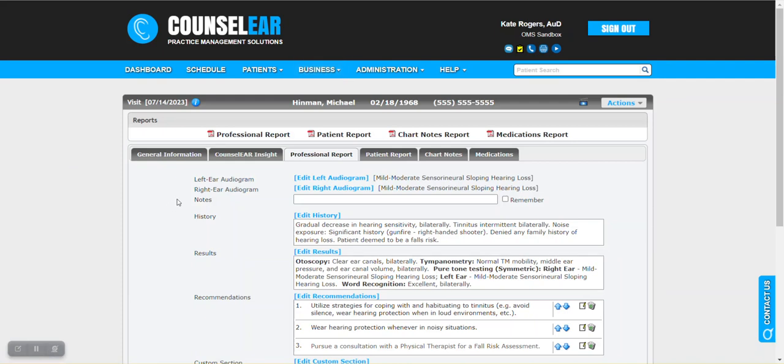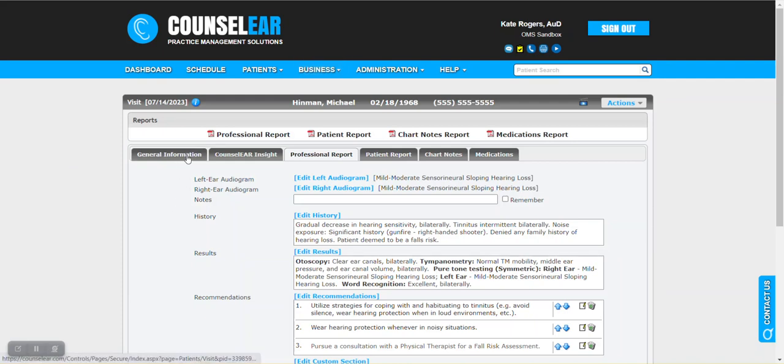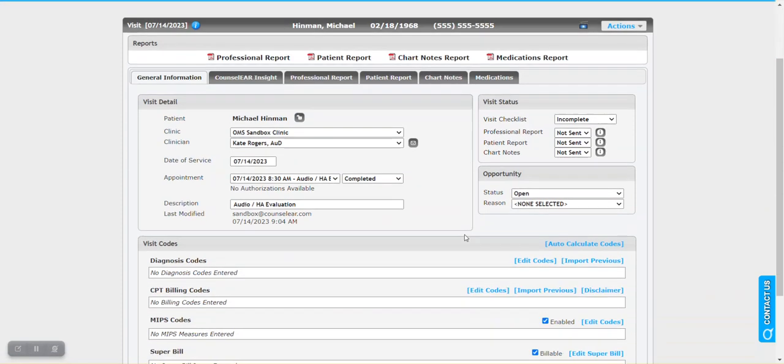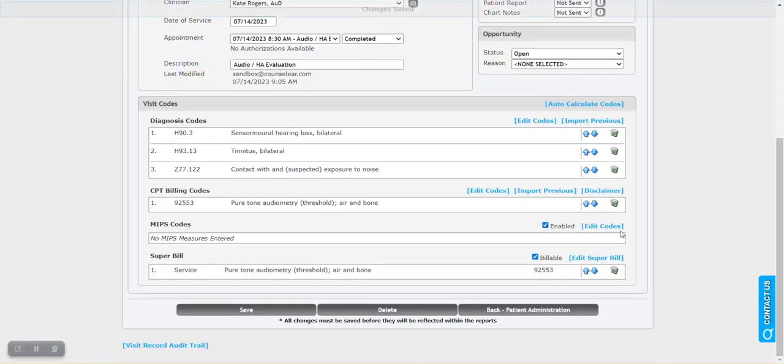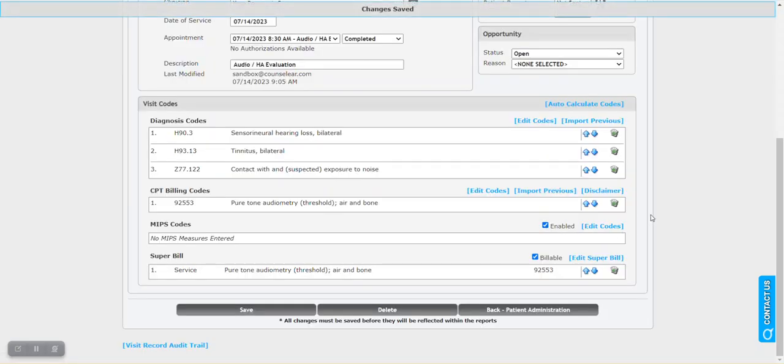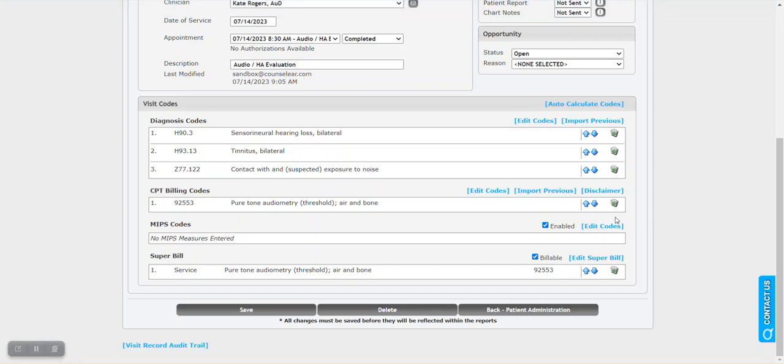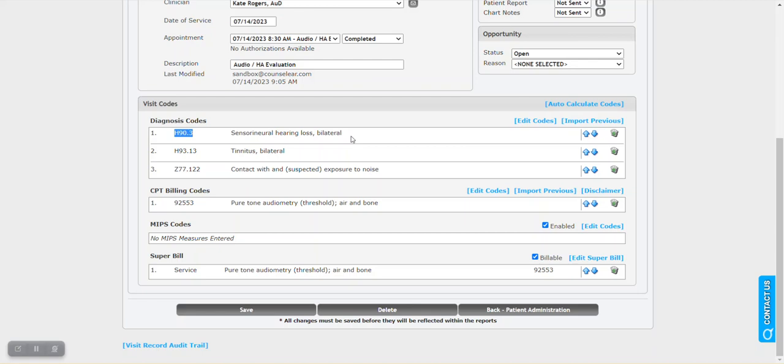So kind of back to our workflow here, we have the classification in place. The other way in a very significant way can assist you is with determining ICD-10 codes. So by clicking on autocalculate codes, Counselor can look out to the entire encounter, the case history plus the test results, and help you determine the appropriate codes. The first one that shows up here, this H90.3 bilateral sensorineural hearing loss, is directly from the classification that was made in the audiogram. So it takes that information out. This is a pretty straightforward one, but if you had a more complex hearing loss, if you had mixed hearing loss in the right ear and conductive in the left, those codes get kind of tough. So Counselor will utilize the AMCLAS classification, translate that into the related ICD-10 codes for that specific patient encounter. So once again, it provides consistency across your visits, not only for yourself, but if you have a staff, if you have many audiologists and hearing health providers who need to do coding, you can do so very easily.